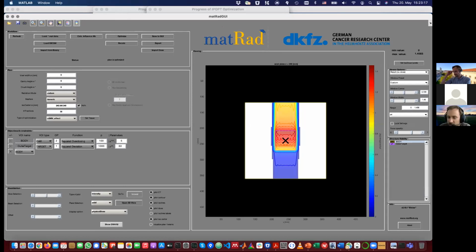So we are rather far away from computing distributions that maximize your carbon ion distribution on a very local level, because the uncertainty underlying these parameters is still way too large. If we knew them perfectly and could pin down in a voxel what tissue exactly is in there and what alpha beta parameters it has, then you could create extremely personalized or tissue-optimized carbon ion distributions that factor in the biological impact.